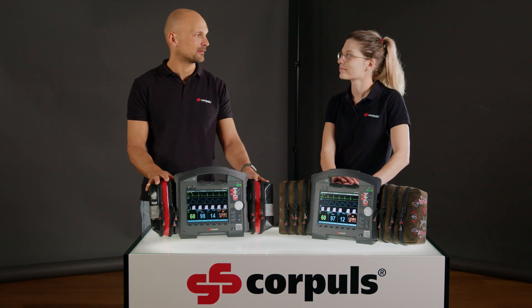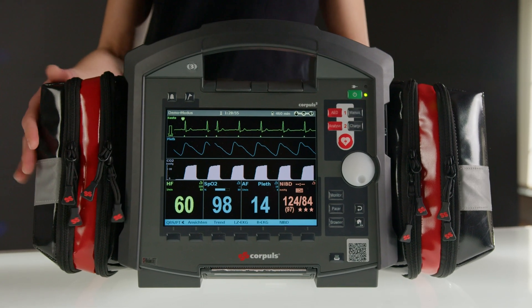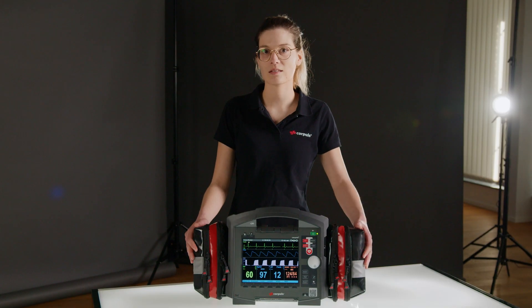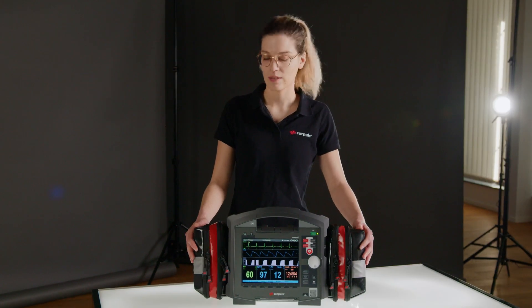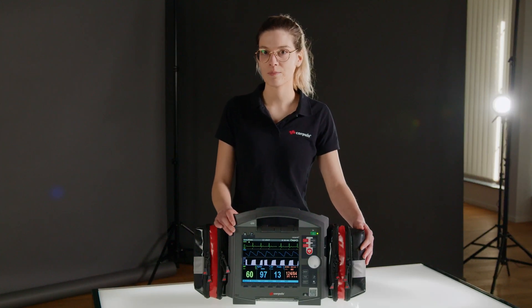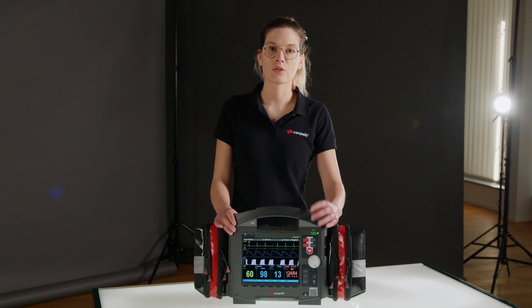Verena is going to quickly show us what is hidden in all the pockets. The ECG monitoring cable and oximetry are located on the outer left. The outer right holds blood pressure measurement and capnometry. You will find the resting ECG cable on the inner left and the feedback sensor for resuscitation. The temperature measurement and invasive pressure measurement are on the inner right.